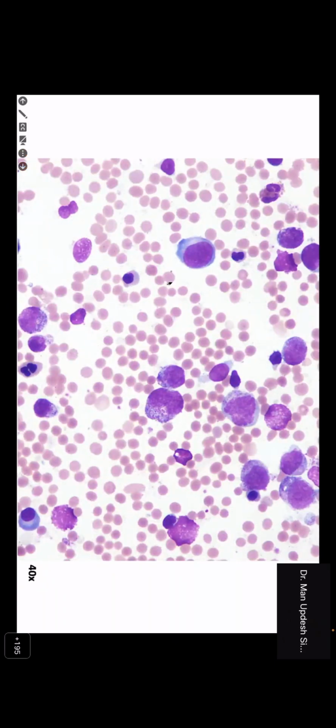So what kind of cells do you see? These are myeloid cells. These ones have hemoglobinized cytoplasm. These are the late normoblasts, and those are the early normoblasts. You identify late normoblasts because of their hemoglobinized cytoplasm and clumped chromatin. And of course, there are myeloid series cells. So you see erythroid cells, myeloid cells, megakaryocytes. Basically, the marrow is cellular and shows the important series of cells.